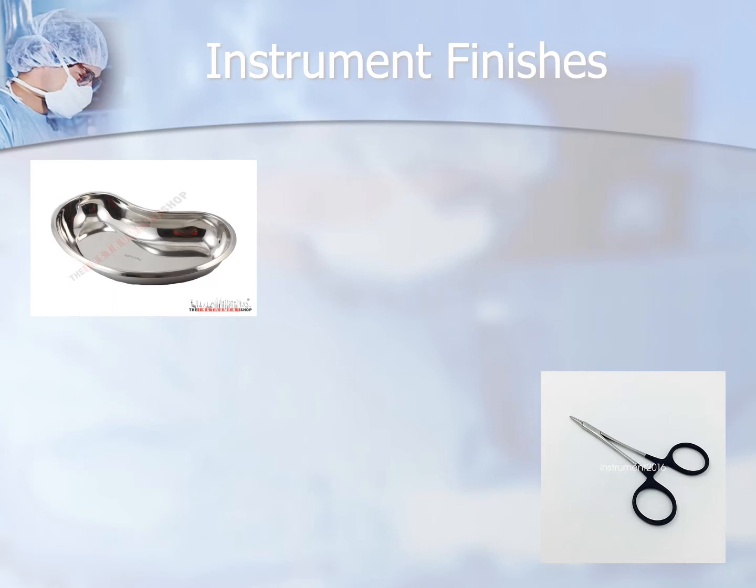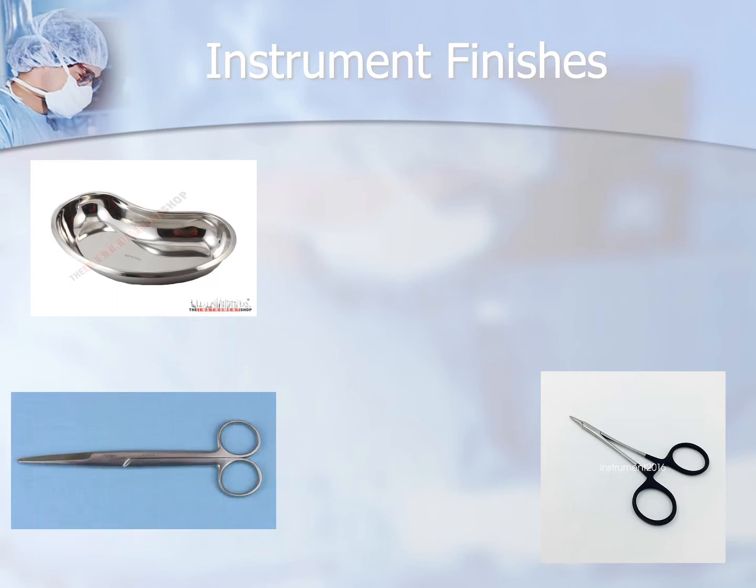These types of instruments are not good for use under a microscope where there is a very concentrated light. That's why we need that satin finish. And that's this guy here. This is the satin finish, this bottom left, the straight Mayo scissor. This one here is the example of the black chromium finish, right? This would be used in laser cases. If you see these black, completely black instruments, those are going to be pulled for laser cases.